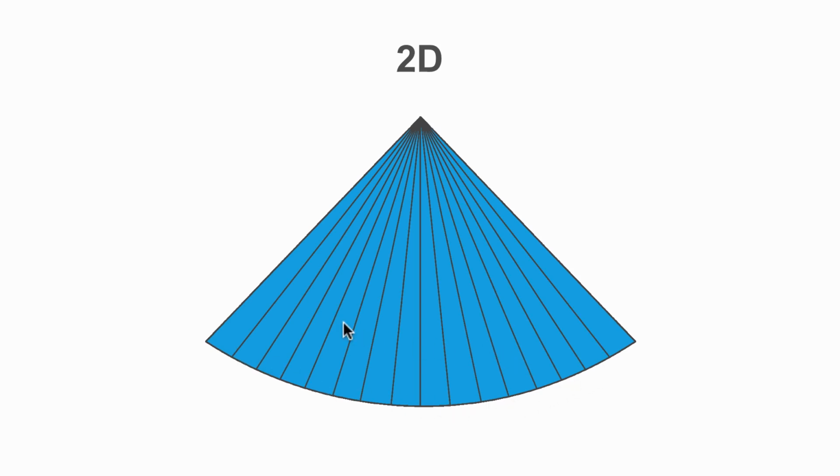Now you can see that this has to be done frequently enough to give us the information to assess the structures we're looking at. So for example, the mitral valve, if your heart rate is 60, is going to be opening and shutting every second. We'll want to see that many times within that second to know exactly what it's doing. So you can see how this temporal resolution matters.